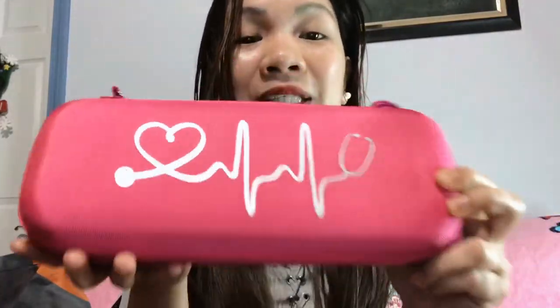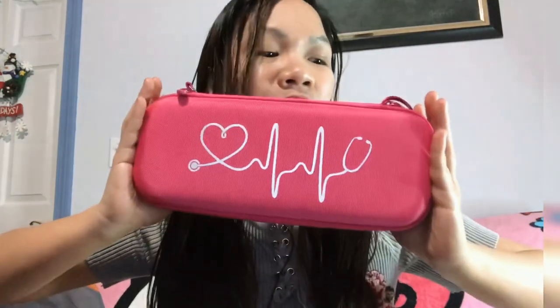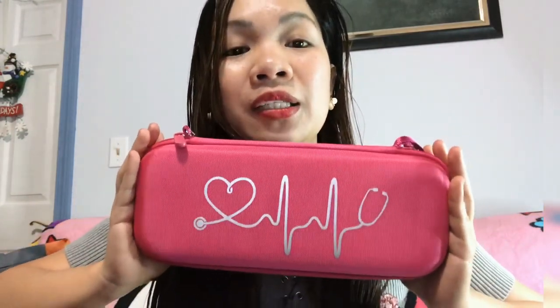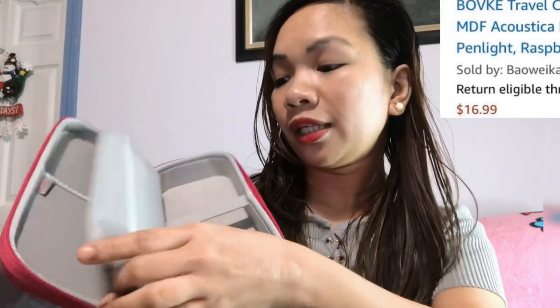I got this first — it's a case storage, a storage where you can put your stethoscope. This is the design: a stethoscope with an ECG and a heart. It's the pink one. It's kind of big — when I first got it I said, 'Oh my gosh, it's a very big one!' But I think it's perfect because I can put my stethoscope in here, and it has a divider too. You can put your pen here.